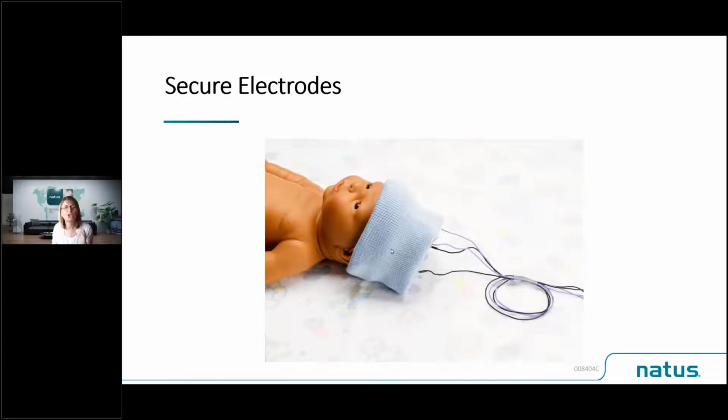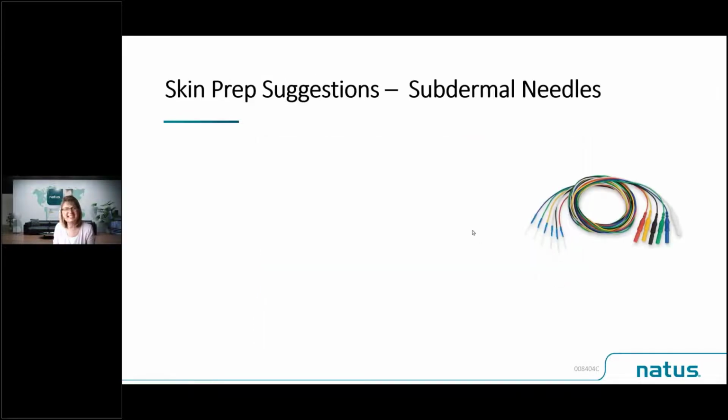But again, it is totally up to your local discretion based on your own local policies and procedures regarding needle safety. So make your strain relief loop to help prevent dislodging if the electrode gets pulled at this distal end. Just a few tips in terms of skin prep.